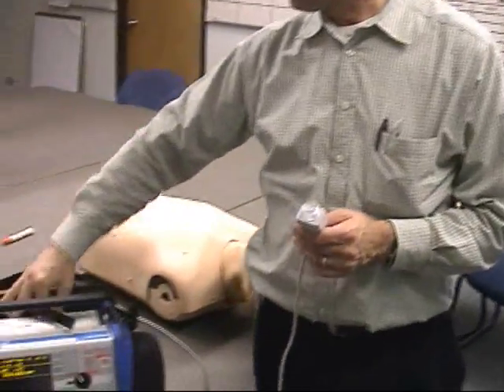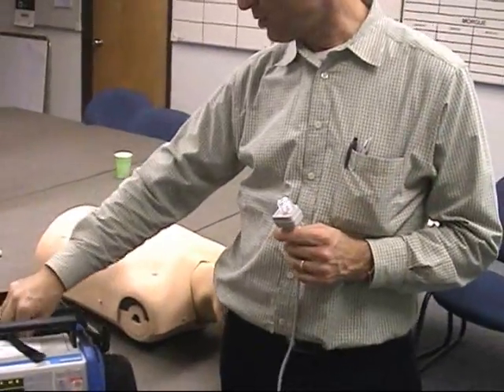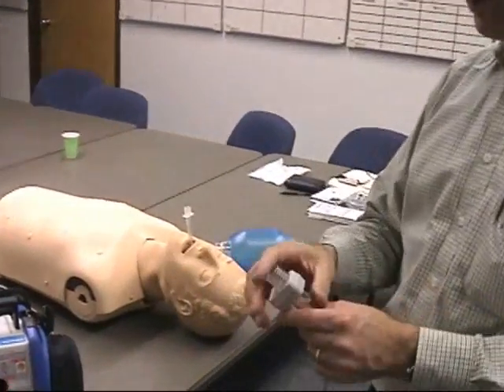Roy Knifton from Zoll Medical. We're just going to discuss zeroing the end-tidal CO2 sensor on the M-Series. The first time that this sensor is attached to this monitor, they need to be paired by zeroing them.